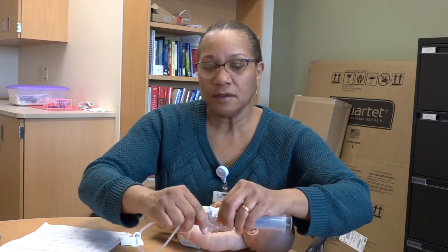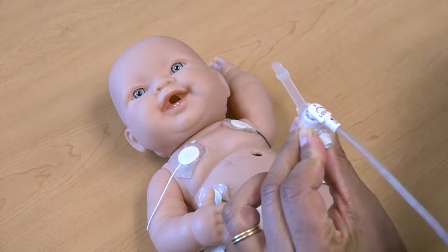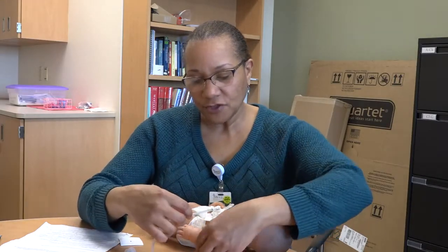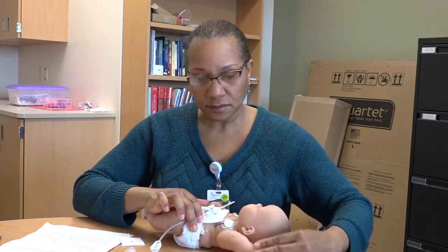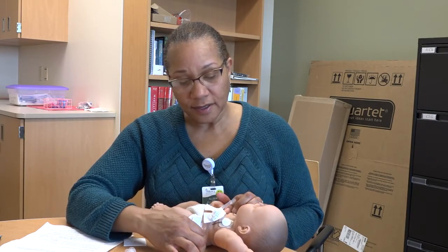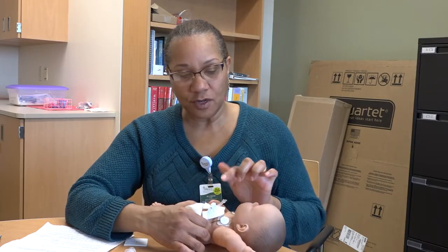We had mentioned having the feeding extension tubing attached for 2 weeks after surgery, and so that's going to look like this. While your baby's in the hospital, they will be using what we call a FlexiTrack, and the FlexiTrack is just an attachment that goes on the skin and holds the tubing in place. Okay, and then you don't have to worry about that. You just need to be sure that this isn't being pulled too tight, that it's not pulling the feeding tube down, that the attachment just is straight up and down without any pressure anywhere.